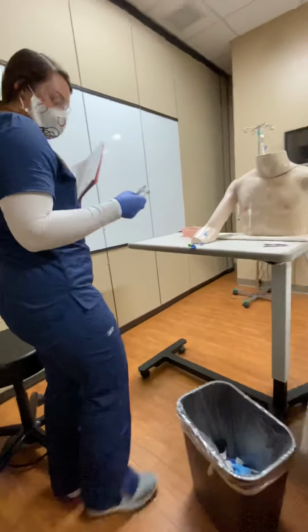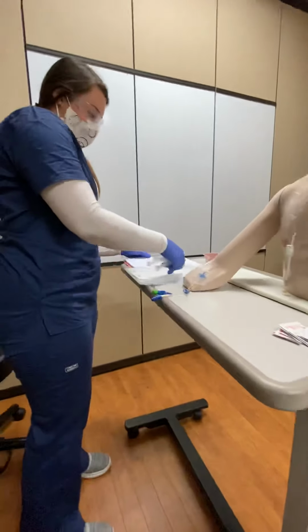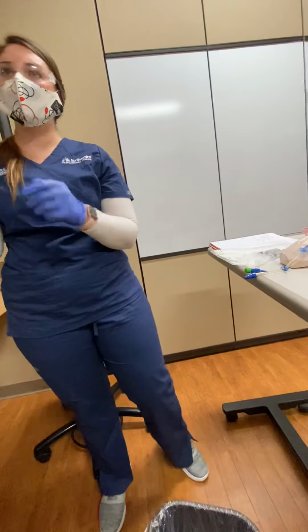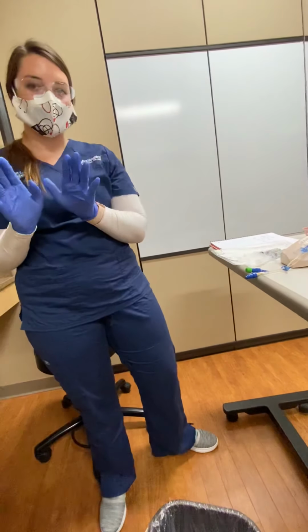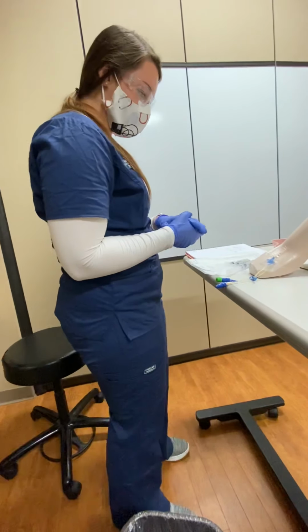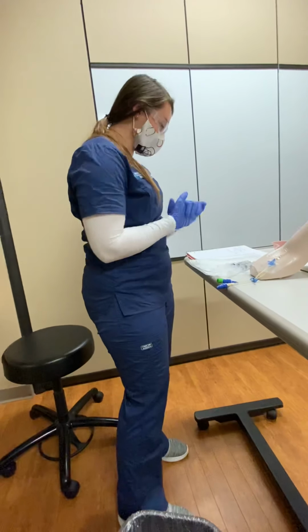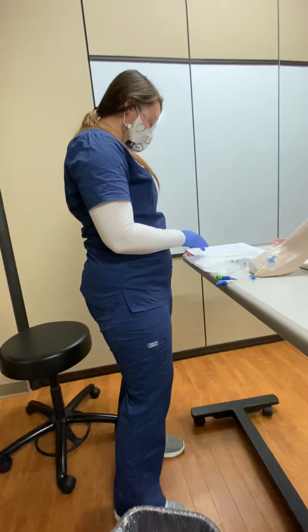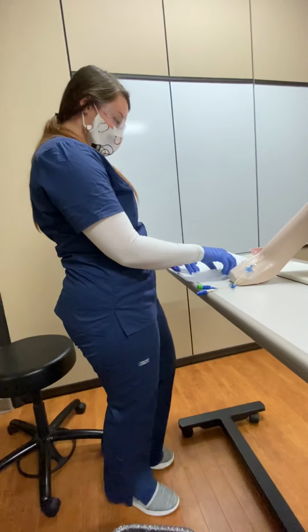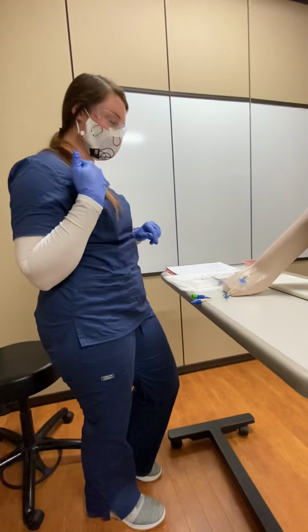Hi, Mary. I'm Nicole. I'm your student nurse today. I'm going to wash my hands, provide privacy, put on gloves, or I won't put on gloves yet. Can you please state your name and date of birth for me? Checking the name tag, date of birth, perfect. All right. So the doctor has ordered some Zofran for your nausea, and I'm going to be putting that through your central line or central IV.